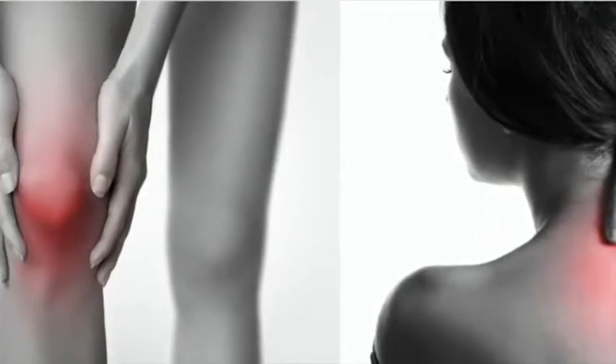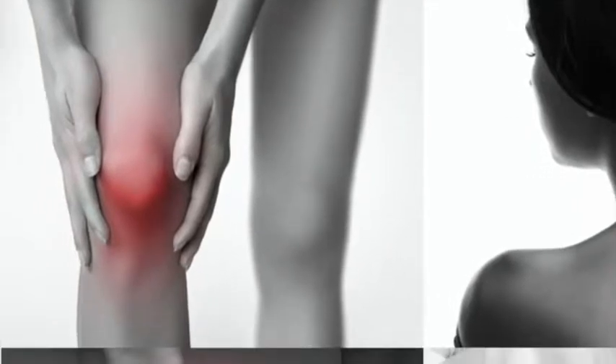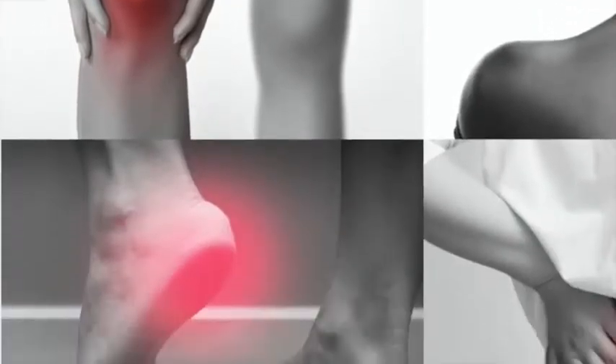Are you suffering from lower back pain, knee pain, shoulder pain, sciatic, muscle pain, or any chronic pain?